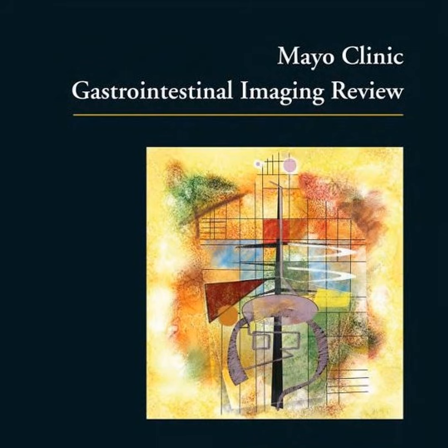Right. And this is where magnetic resonance physics yield an incredible diagnostic advantage. Iron is paramagnetic. So when iron accumulates in the splenic macrophages, it causes local magnetic field inhomogeneities. On specific MRI sequences, particularly gradient echo or heavily T2-weighted sequences, this iron causes a rapid loss of signal known as T2 star decay. And the practical result of that is amazing.